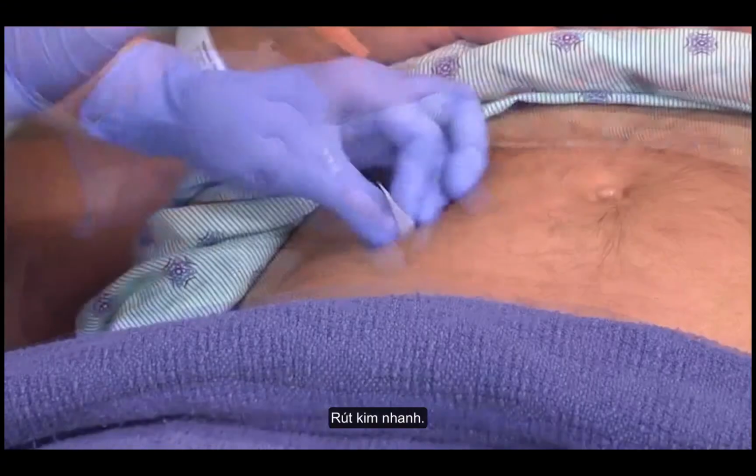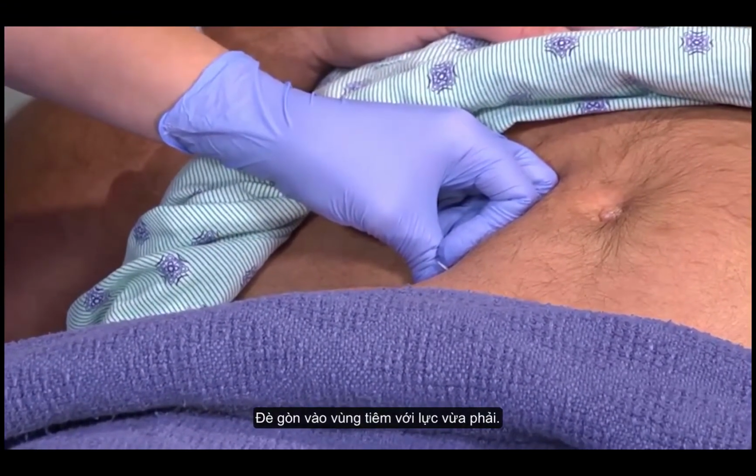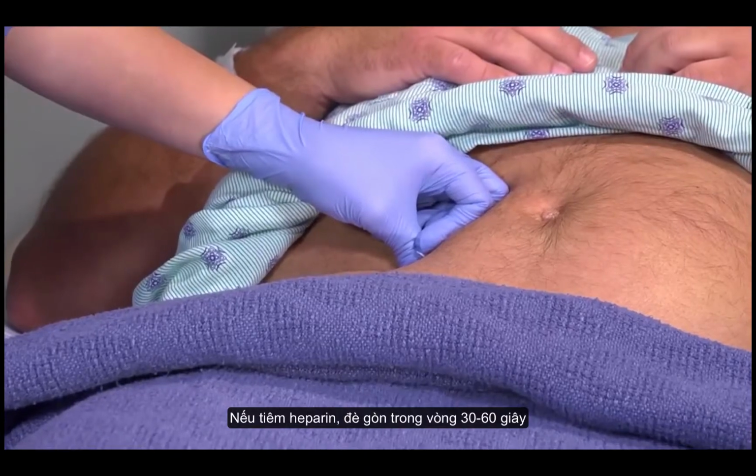Quickly withdraw the needle. Place a swab or gauze pad on the site and apply gentle pressure. But don't massage the site. If you've just given heparin, hold the pad on the site for 30 to 60 seconds.